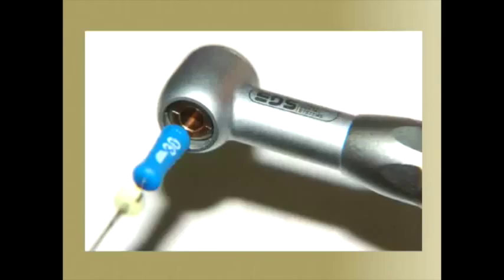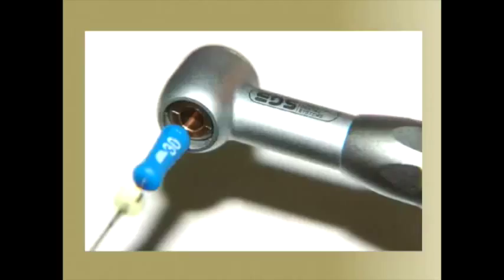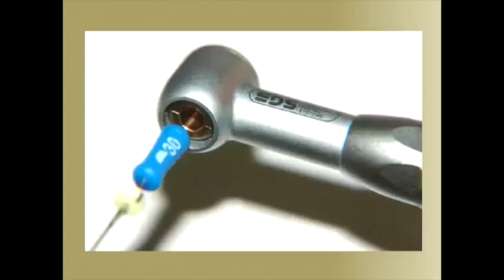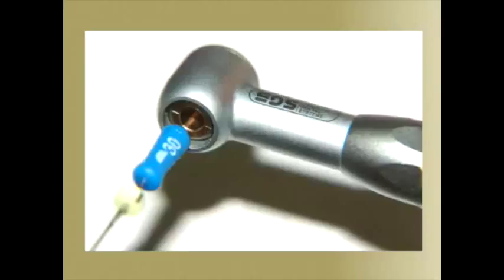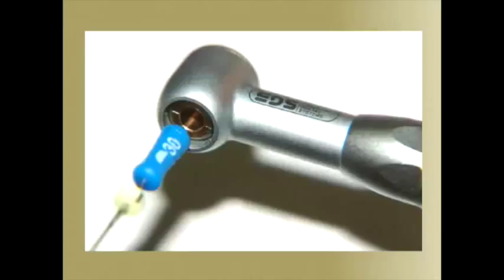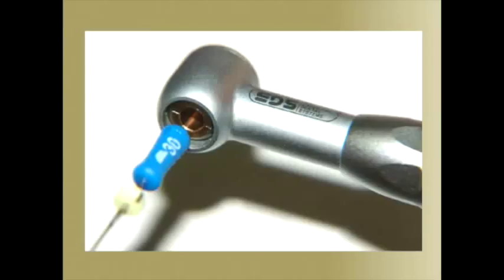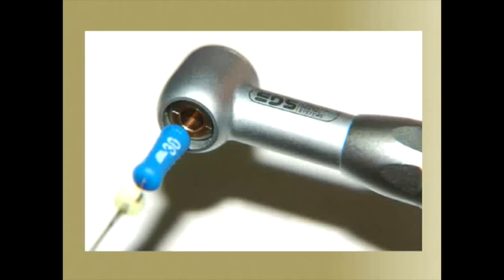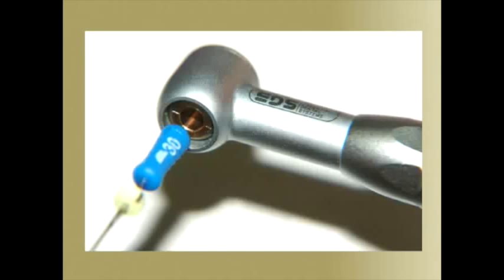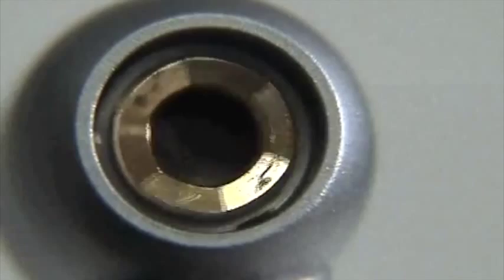Please note that the handpiece is a receptacle for hand instruments — in fact, any one of the instruments can be used manually, but they are used so much more efficiently and safely in the handpiece. Once one gains the confidence that the instruments truly remain intact even when used aggressively against the buccolingual walls of the canal, the dentist will be comfortable using them in the reciprocating handpiece immediately after gaining length measurements. Here is a video showing the short arc of oscillation, revving up to 3,000 to 4,000 cycles per minute, allowing full shaping of most canals in a matter of a few minutes.